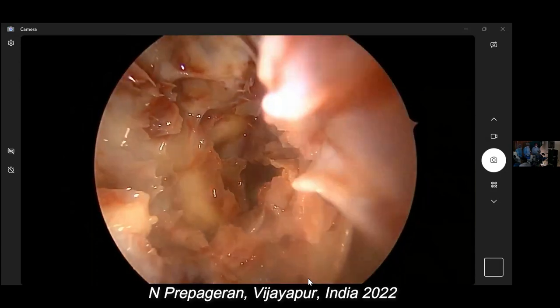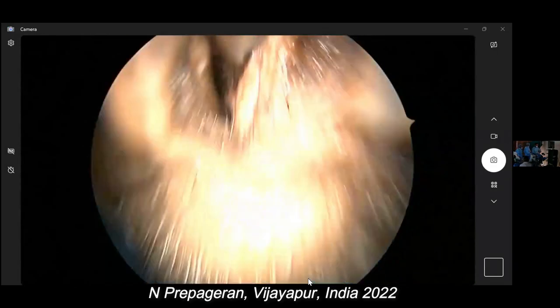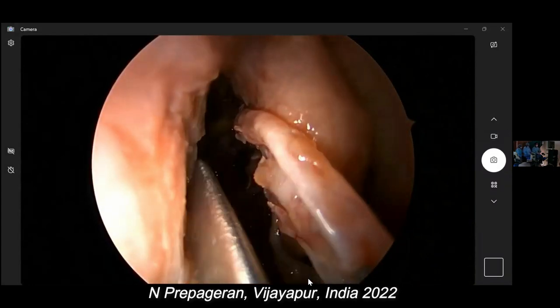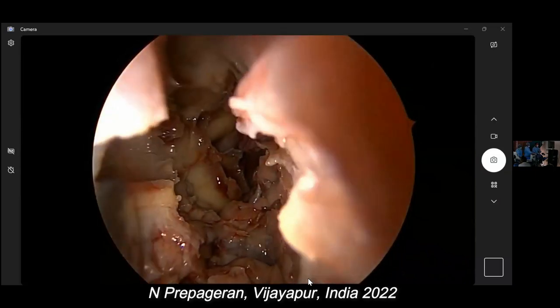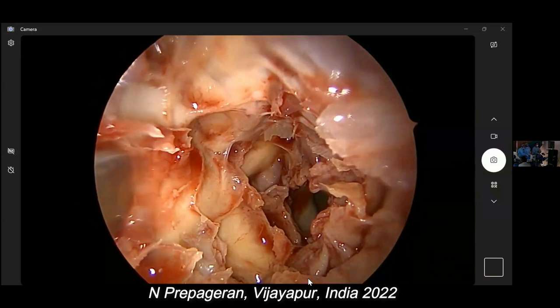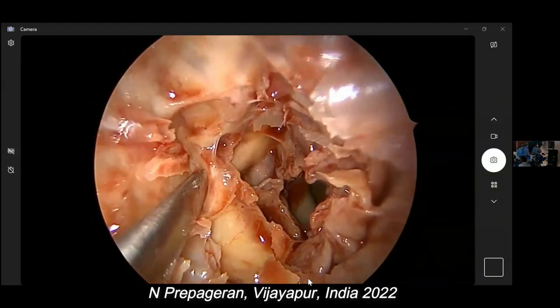Okay? So now what I'm going to do is an orbital decompression. How many instruments did we use so far? Four. Three. So now, we remove all the bone. That's your orbit. Can you see? So to do an orbital decompression, use a Freer elevator, dissect, and remove the bone.